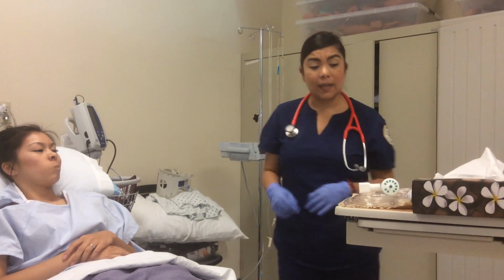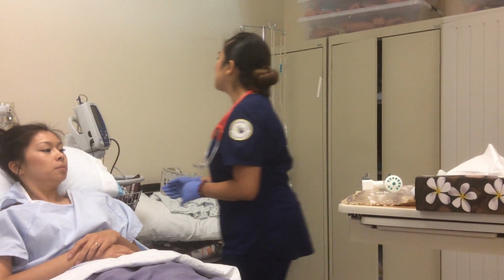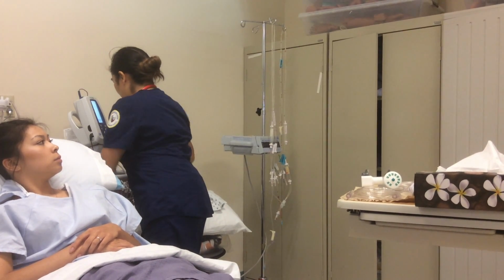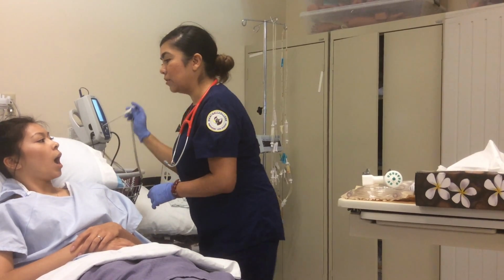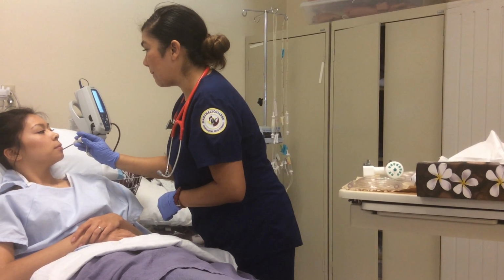Okay. And so now what I'm going to do is I'm going to take your temperature. Okay, this is going to go in your mouth here. Just there you go. Now, just one last thing before we begin, okay?